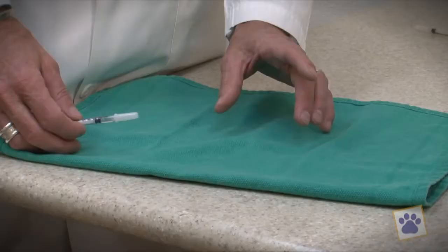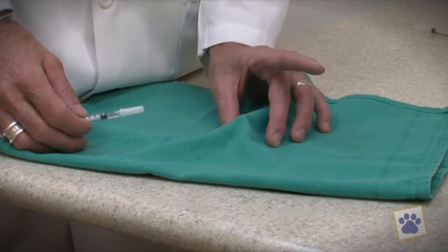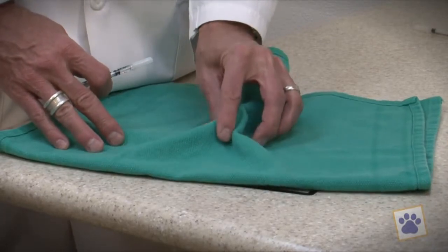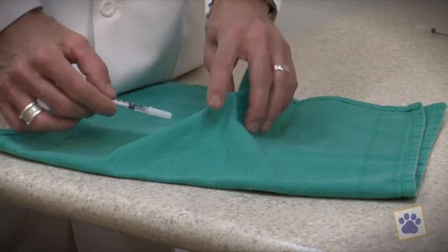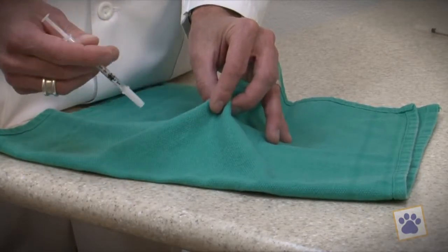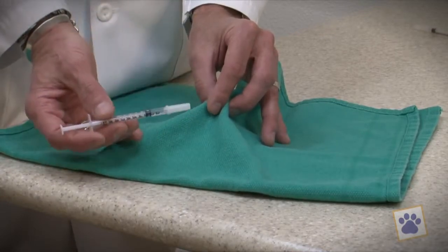We give these allergy injections into a skin tent. Prior to doing this on a dog, I want to show you how it's done on a surgical drape. Pinch the dog's skin right over the shoulder blades with your thumb and your middle finger, and then take your index finger and go right between that and squeeze together and pull up. What that does is it makes three folds, and pulling up creates a nice little tent underneath the skin. That subcutaneous tent is exactly where we want this injection to go.